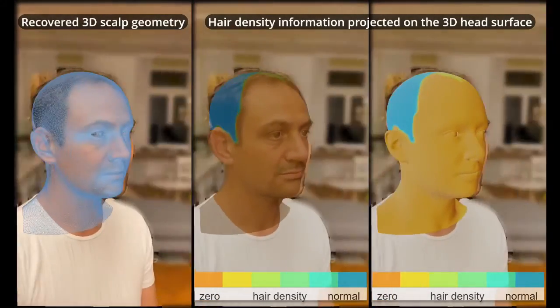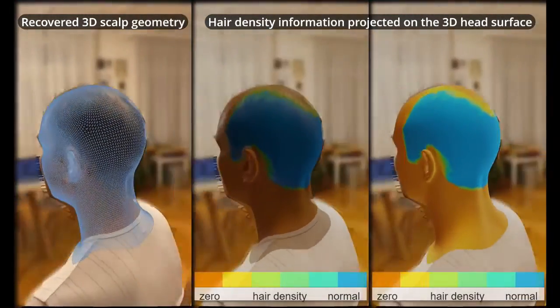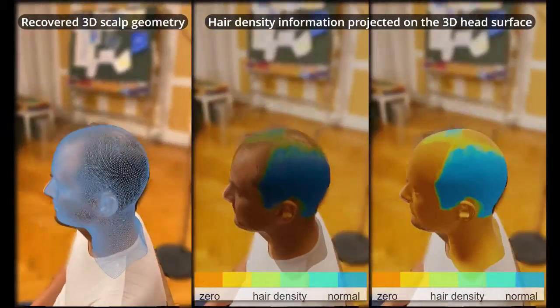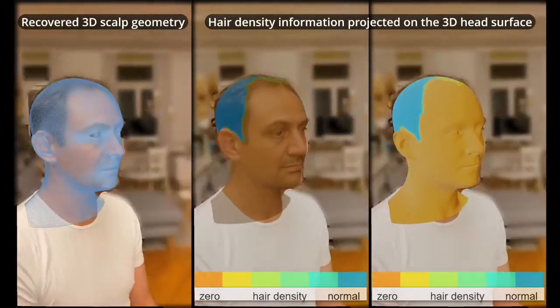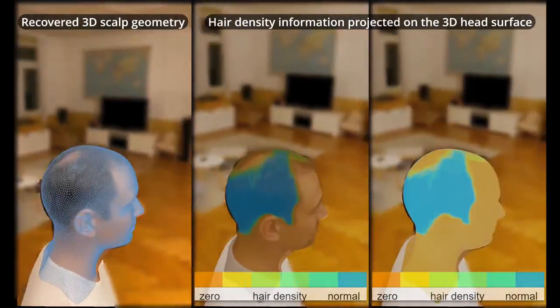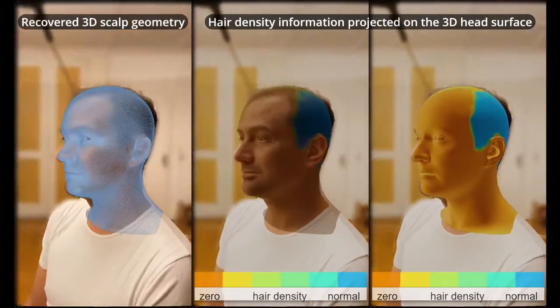Here is an example of the output mesh anchored back on the original video. Once obtained, it can be used to map image texture information like the hair density shown here. Thanks to the consistent mesh topology of the 3D morphable model, the mesh can be used to easily compare a specific location on a person's scalp at different time points as well as between subjects.